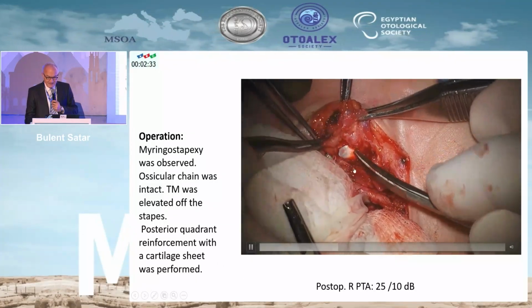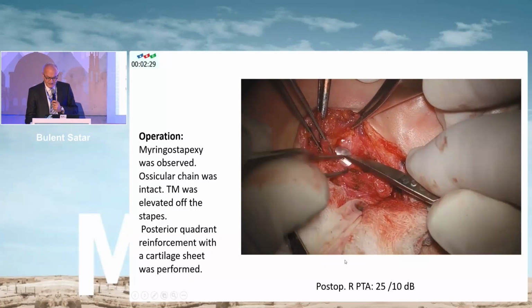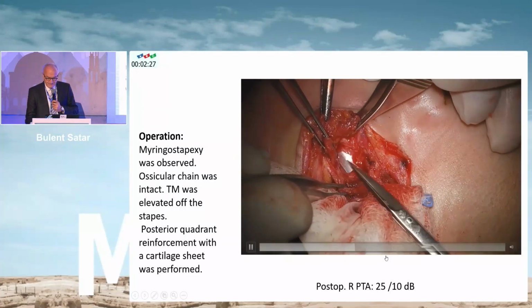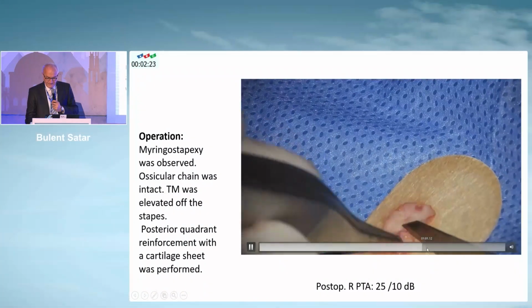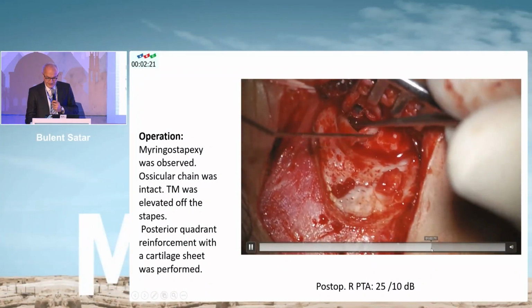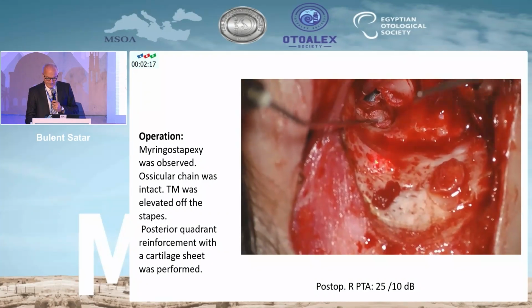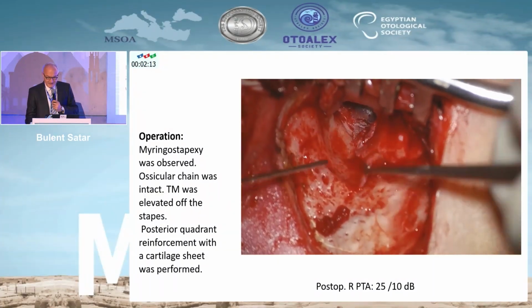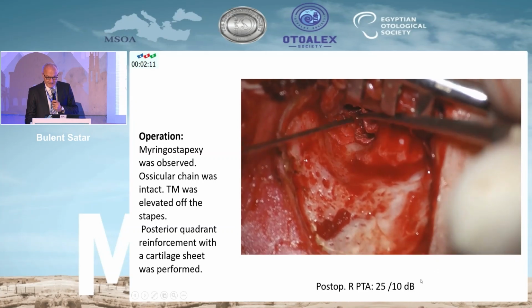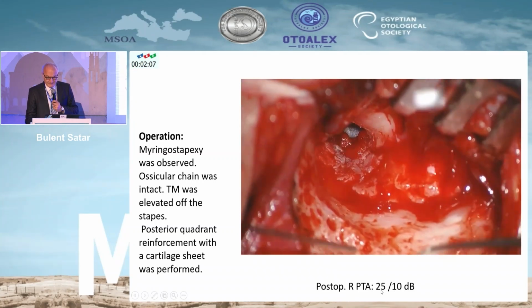This is the template. I used conchal cartilage. We prepared the cartilage. Postoperatively, she had a little bit decreased hearing, but it was still within normal limits.